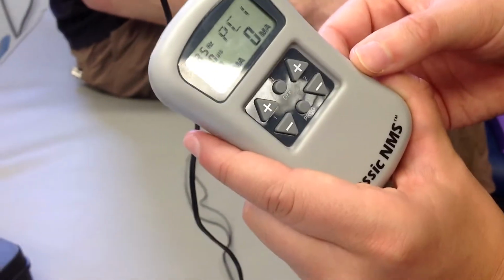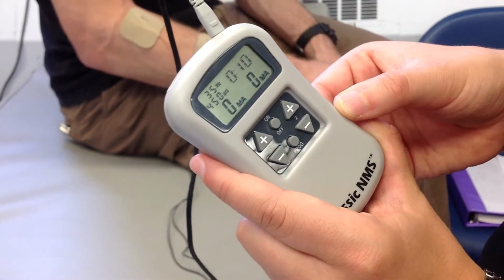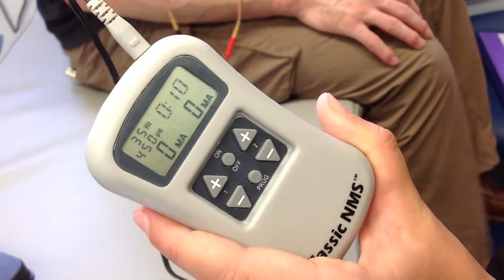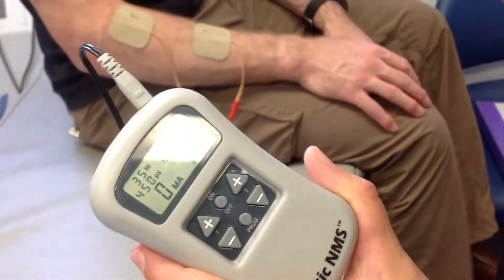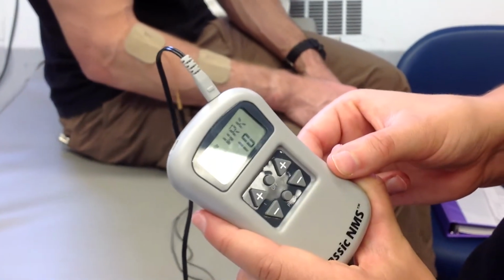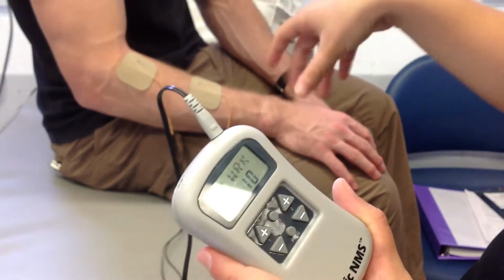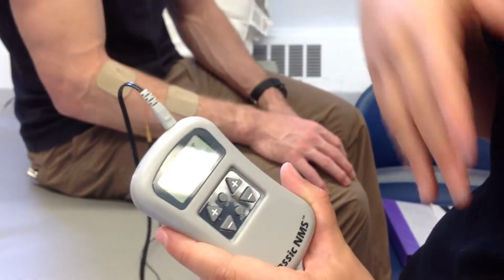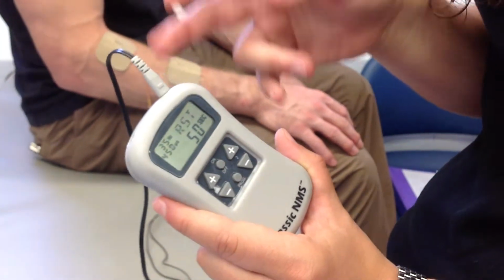And then you could hit set again to change the time. We're gonna do 10 minutes of the whole entire thing. You hit set again, you can change your work. So he's gonna feel it for 10 seconds, and you hit set again. Rest, he's not gonna feel it for 50 seconds. So it's a 1-to-5 ratio.